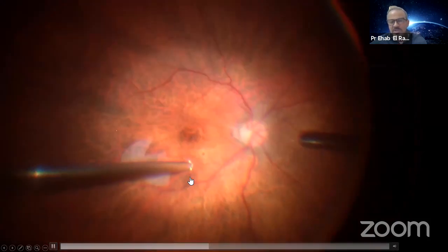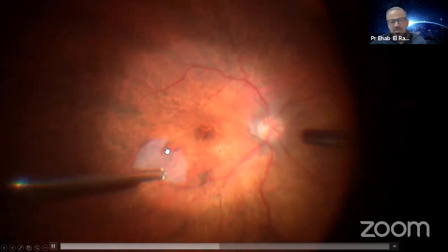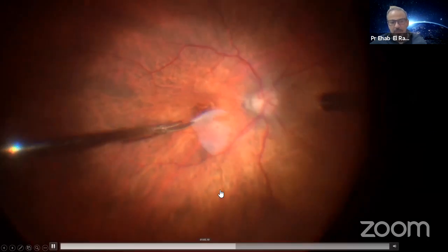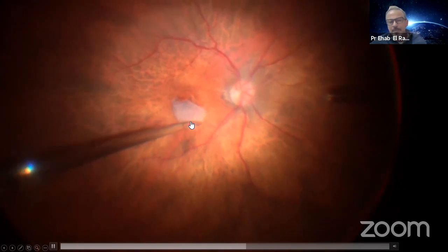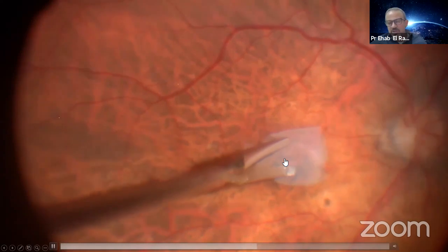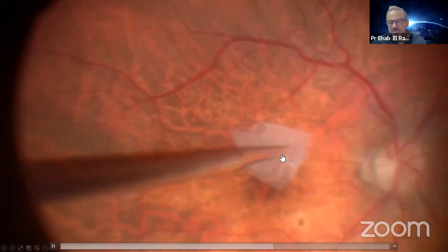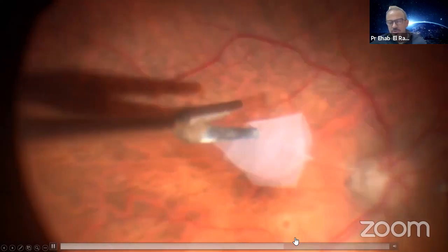That piece of amniotic membrane is inside the eye, and you can see I'm just cleaning any residual matter. There's the hole again, and you can see that the size of the amniotic membrane is larger than the size of the hole. So I retrimmed it inside the eye again to a smaller piece, try to fold it first, and you see that the sticky part always grips to the instrument. So it's not easy trying to put it right here, it sticks to the instrument, since you already had a larger patch. The undersurface and the oversurface is something to keep in mind if it's fresh. If it's not, you lose the sticky thing there. It sticks to the forceps. That means it's going to dislodge again.